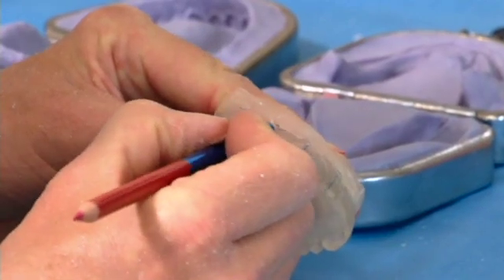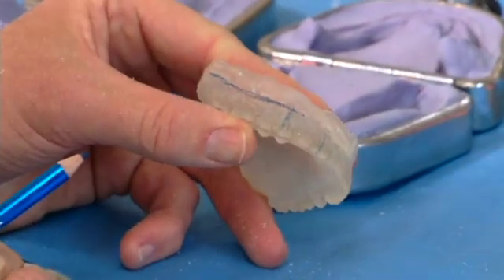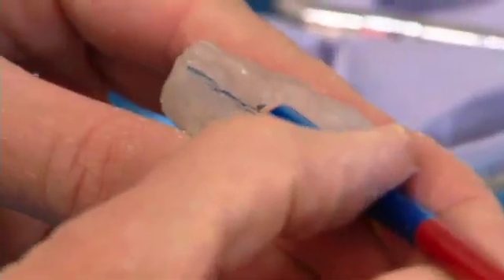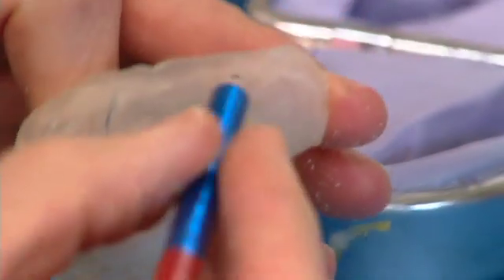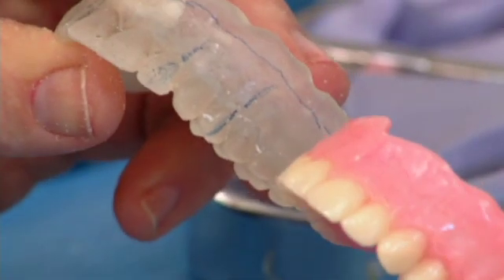In the duplicate, you can actually see the junction of the hydrocast when it was in the approved provisional denture. And the hydrocast came right over right there. You can see the junction of the hydrocast on this side. You can trim that away like we did in the duplicate denture, but there's no need to really trim it away here.